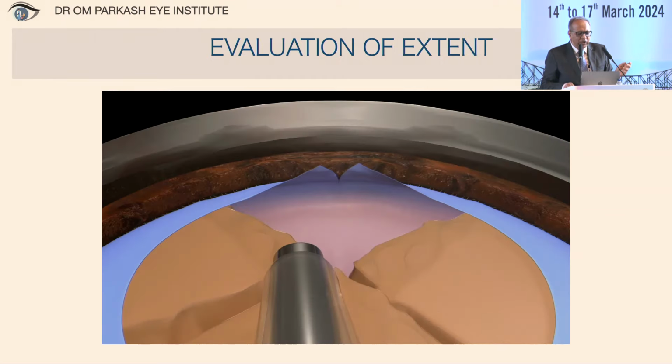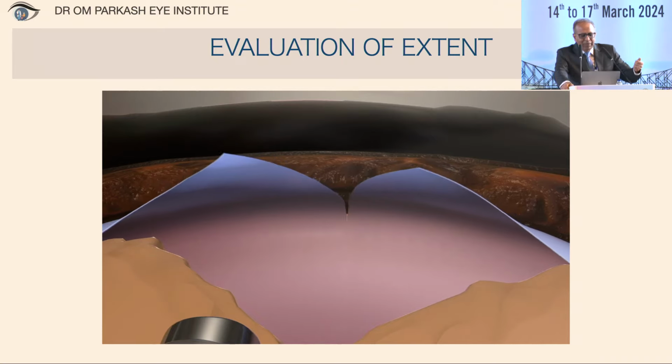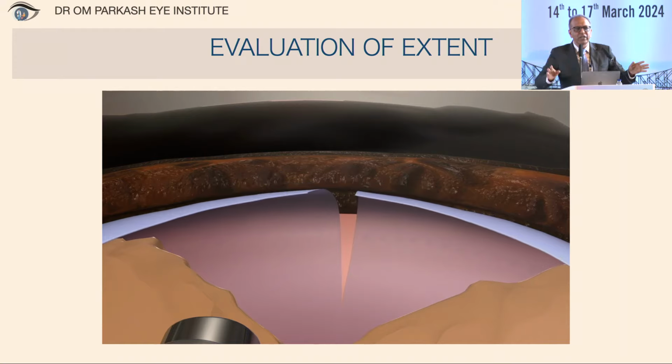Now let's see what it is. With the flap motility sign, we just evaluate if the flaps are fluttering and everted, it means it is pre-equatorial. And if by any means it becomes a wraparound tear, then it is no longer a fluttering flap. It is inverted and non-fluttering.